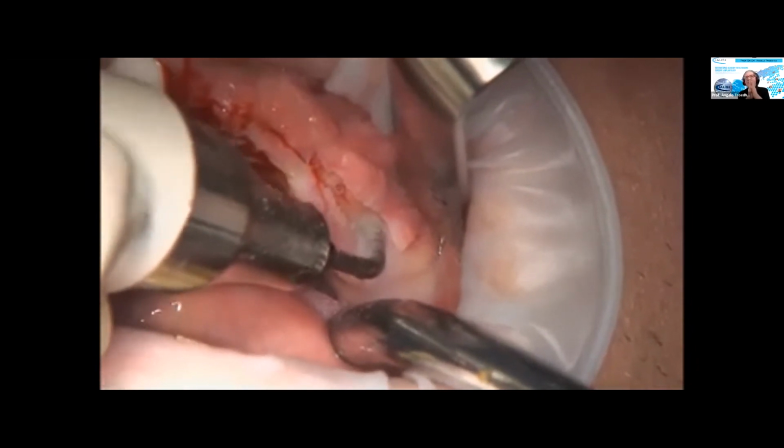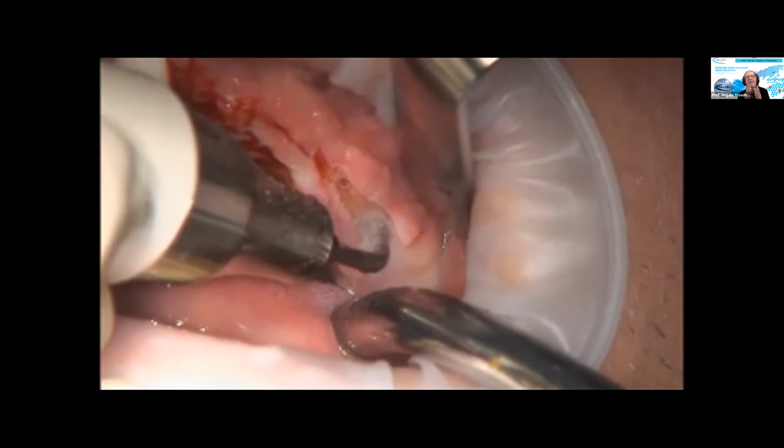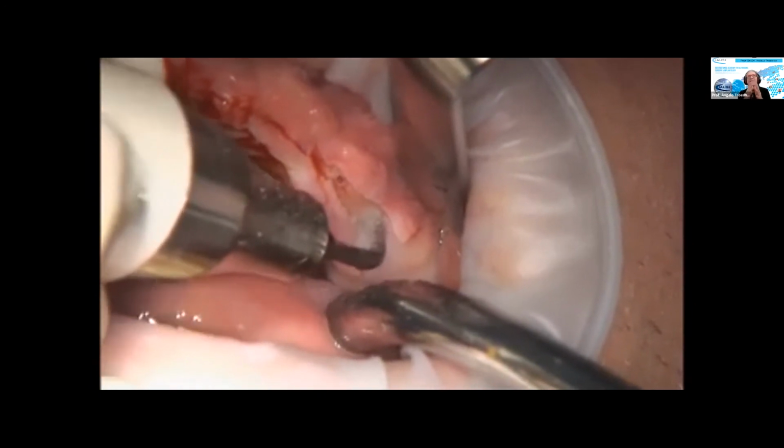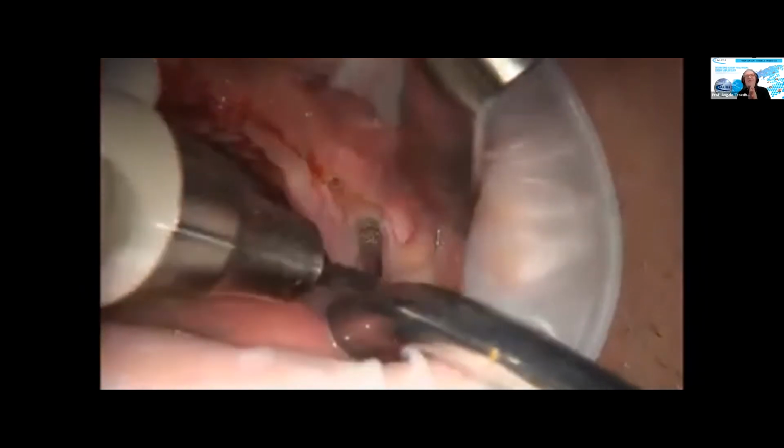And you see, for you, it might seem now so slow. Oh my God, nothing is happening. There is no bleeding. The sound is like calculus removal. Of course, you have to be careful.